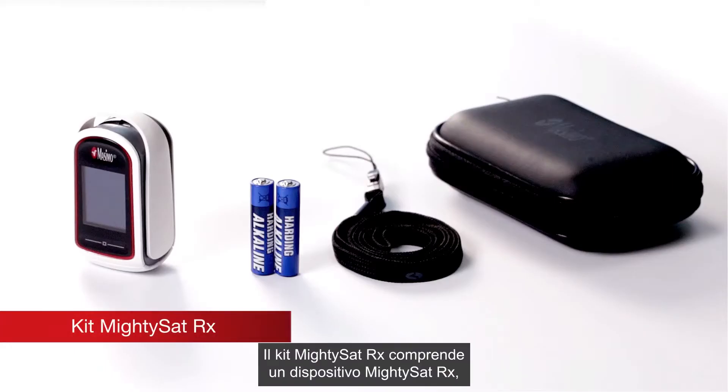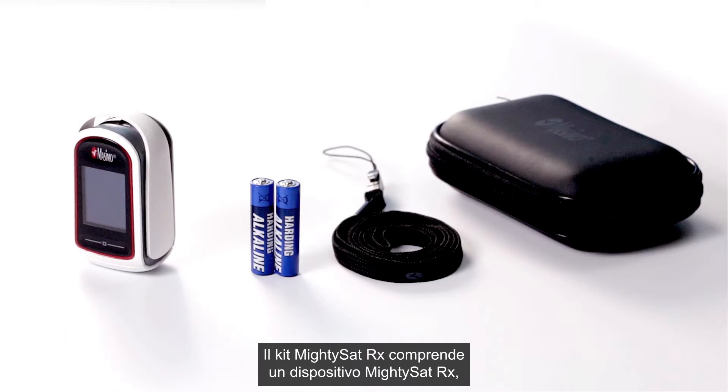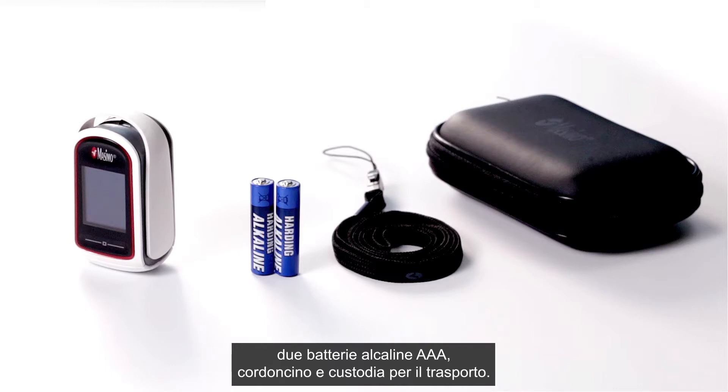The MightySat RX kit includes one MightySat RX device, two AAA alkaline batteries, one lanyard, and one carrying case.